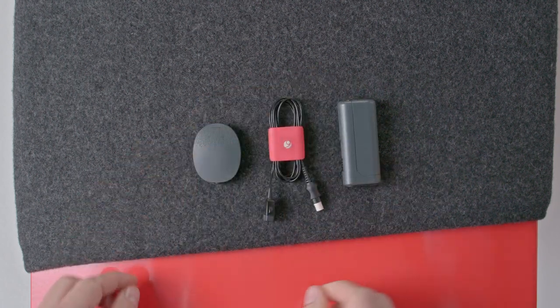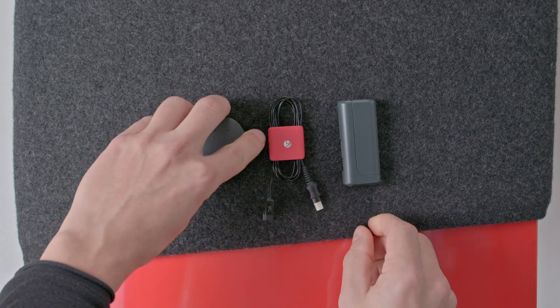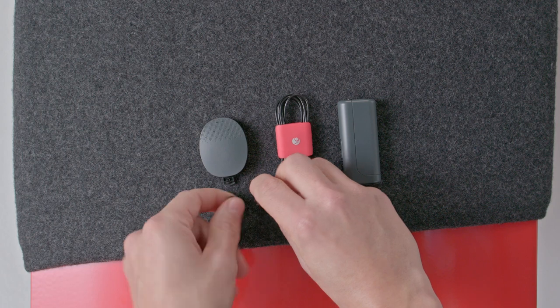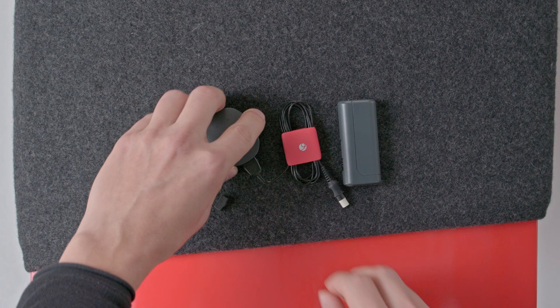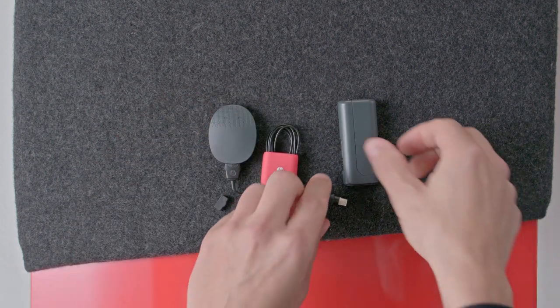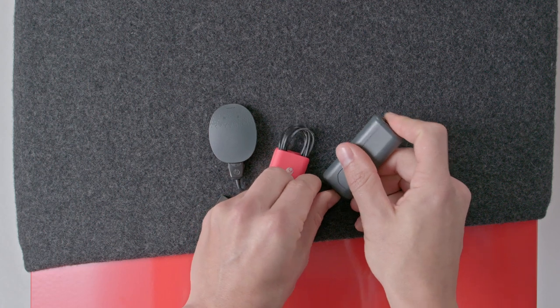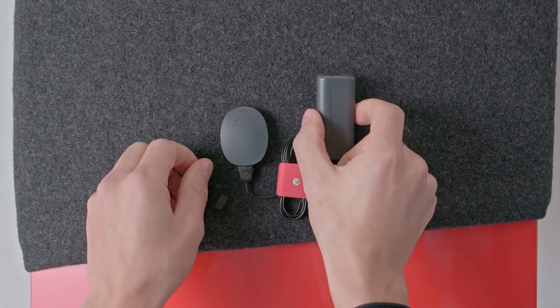Pull gently on the rubber socket cover at the bottom of the processor to open the socket. Then plug the Mini Battery Pack cable into RONDO 3. Plug the other end of the cable into the Mini Battery Pack and switch it on. The Mini Battery Pack can now be attached to clothing or worn in the pouch provided.